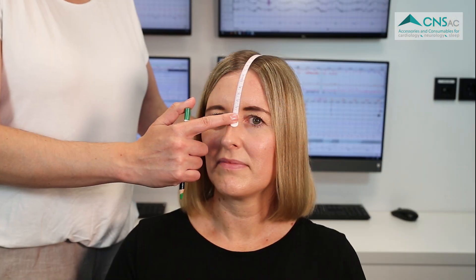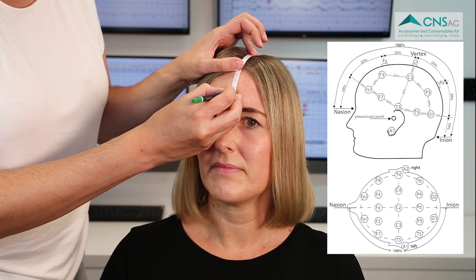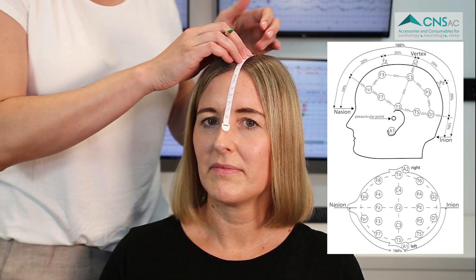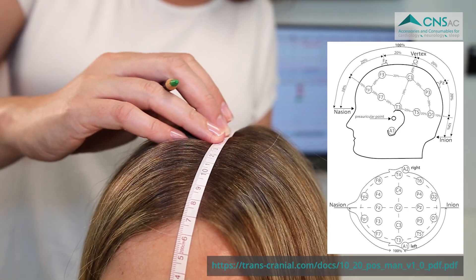The first step is to measure out and mark the EEG electrode position points on the scalp and forehead according to the International 10-20 system. Use a tape measure to determine and mark the position of each EEG electrode point. If you need more information here, please see the following reference.